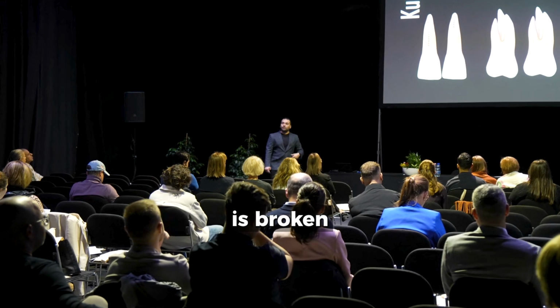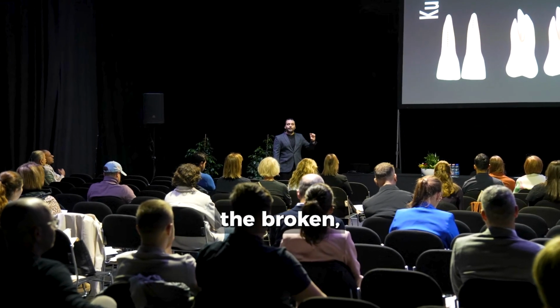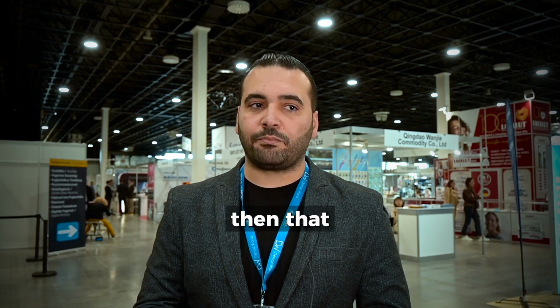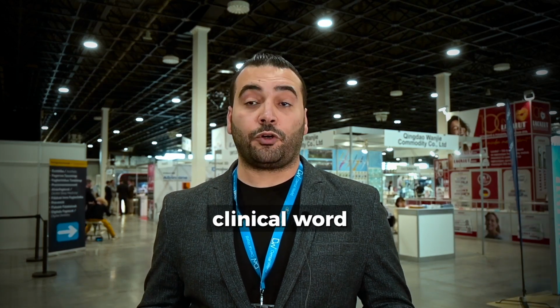But if the file is broken at a coronal level, or even more coronal, before the curve, I prefer, of course, in that case to retrieve. So the main clinical factor, the key clinical word here, is the position of the separated instrument.